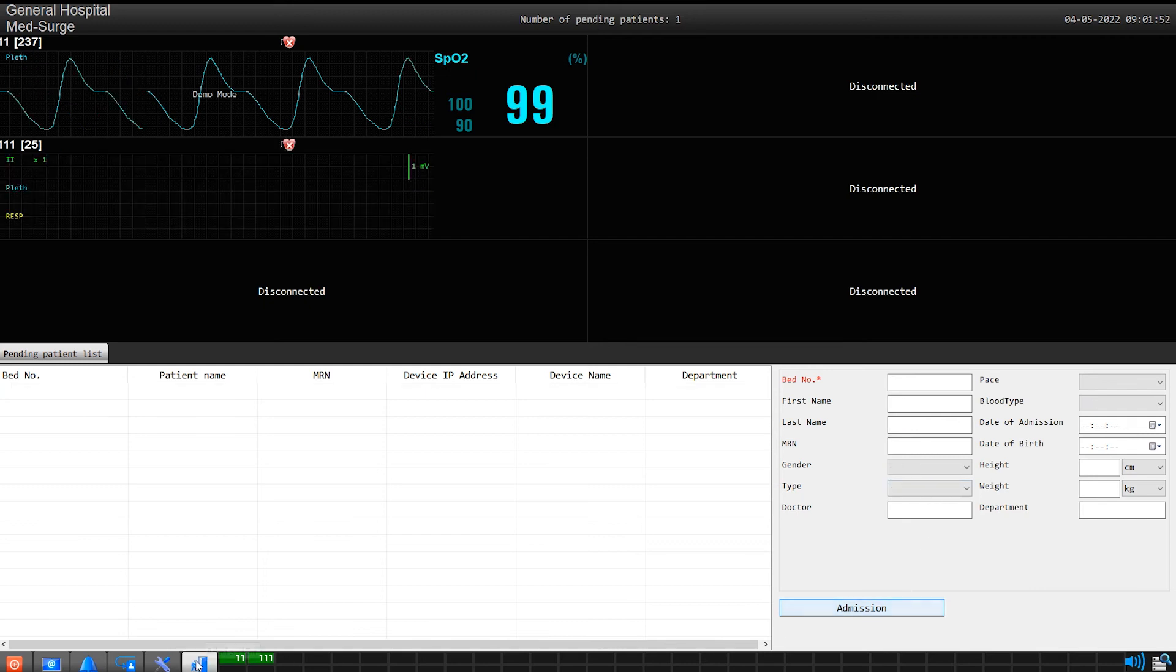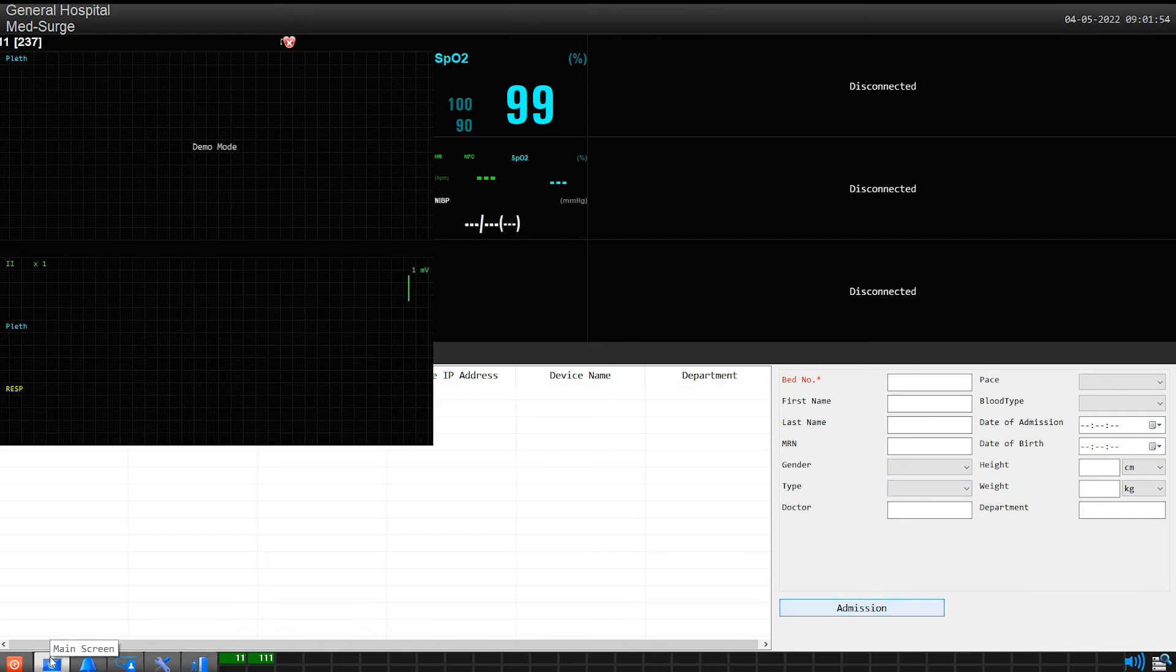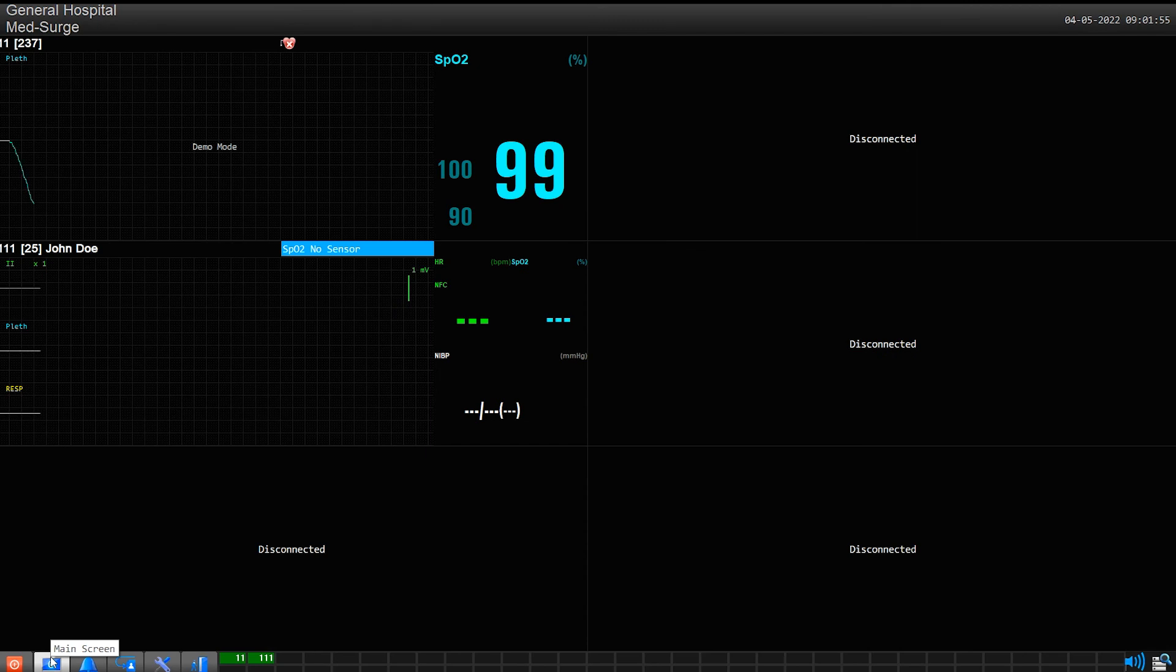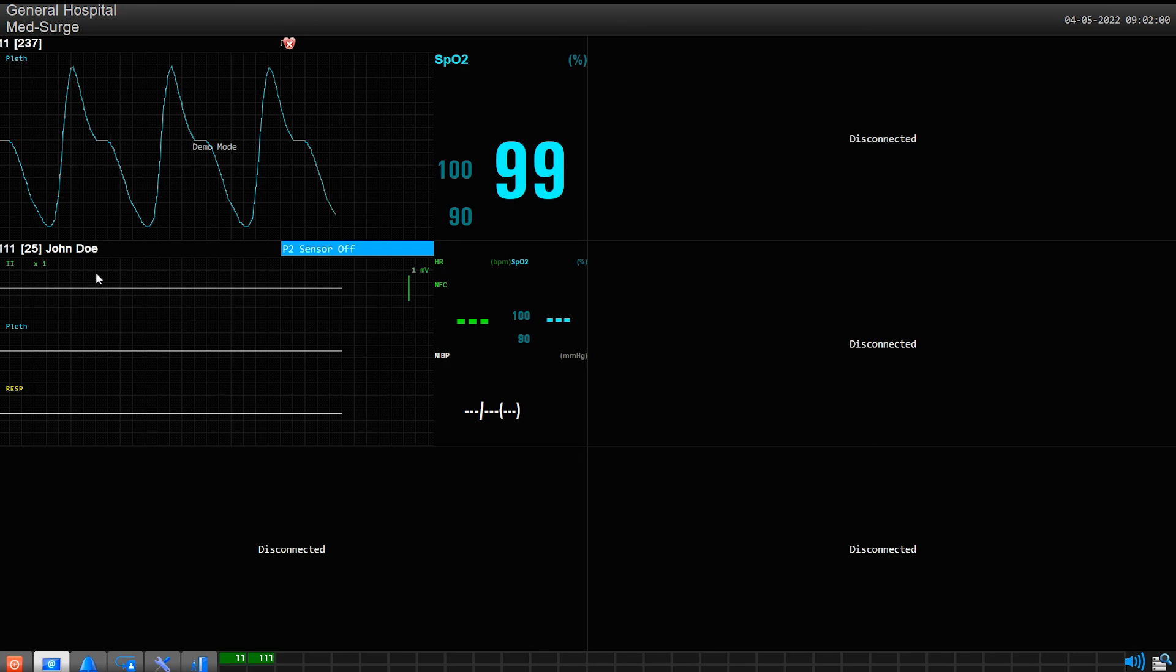The screen will now transition to main viewing status. You should see your patient appear on the screen. Your bedside monitor patient has now been admitted.